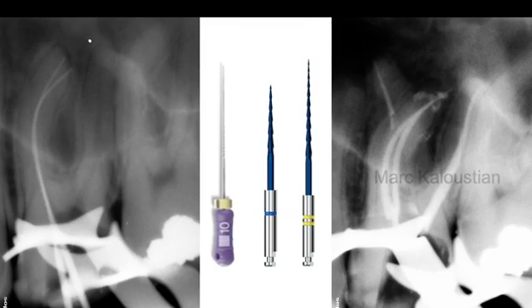So if we take a simple case like this one, it's an upper molar, classical, with two canals in the mesial canal. You can see the X-ray here of the files with the two files inside the mesial canal. In a case like this one, I was able to go to the foramen very quickly with a number 10 file. Okay, I was discussing this topic a week ago with my friend Dr. Marc Habib, and we discussed that sometimes we can go directly with a number 10 file till the foramen.